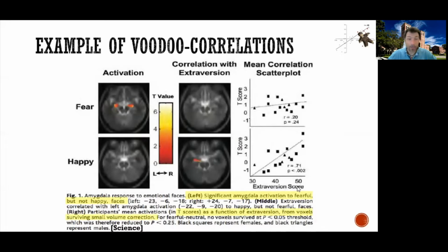Now, how surprised are you? And see, the correlation is really high, 0.71. It's entirely circular. We specifically picked this ROI because it correlates with extraversion. It's not very surprising that if you then take this ROI and do an ROI analysis, you find out that on average, the t-score in here correlates a lot with extraversion. Of course, that's why we picked that ROI.